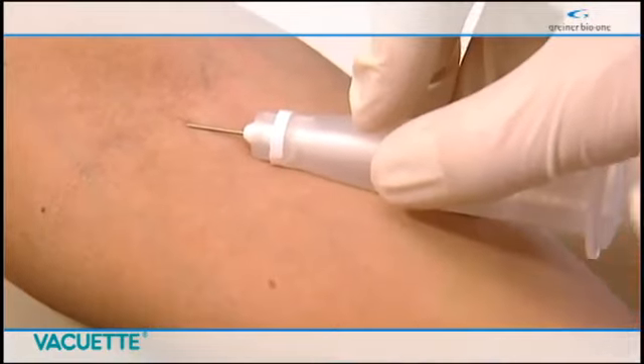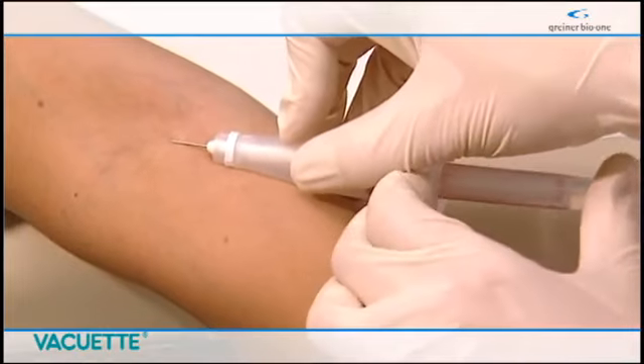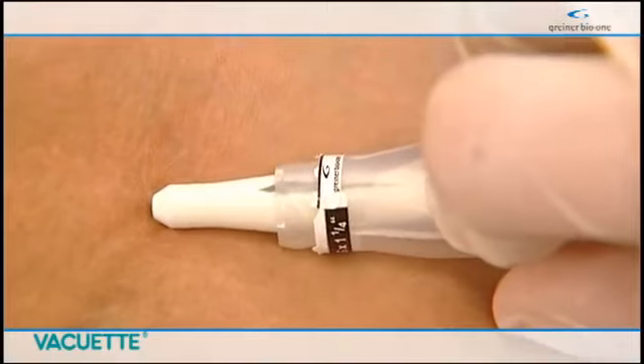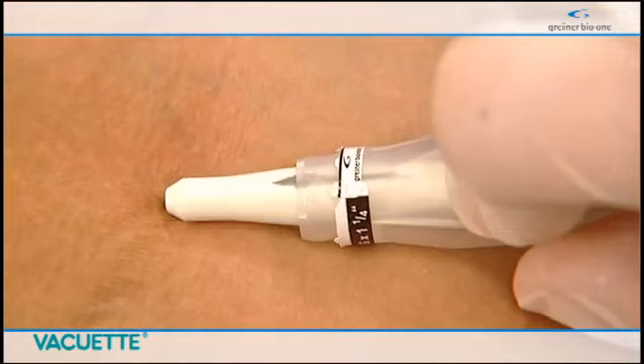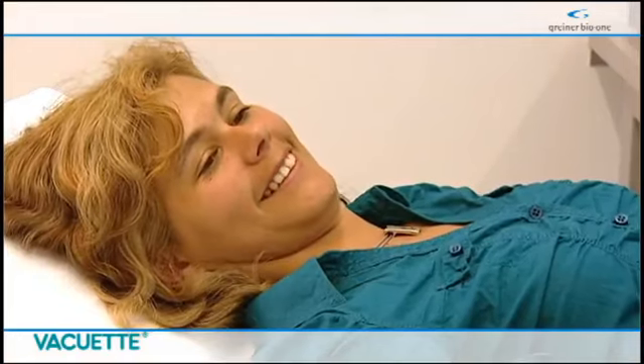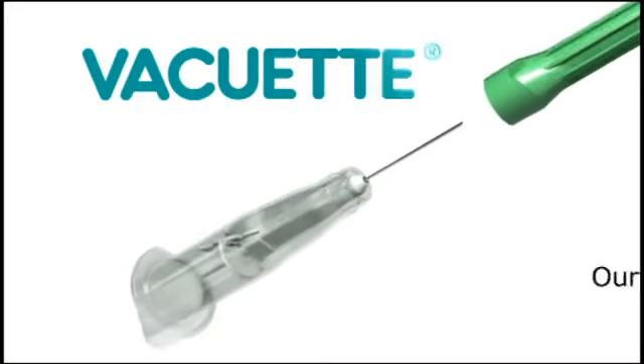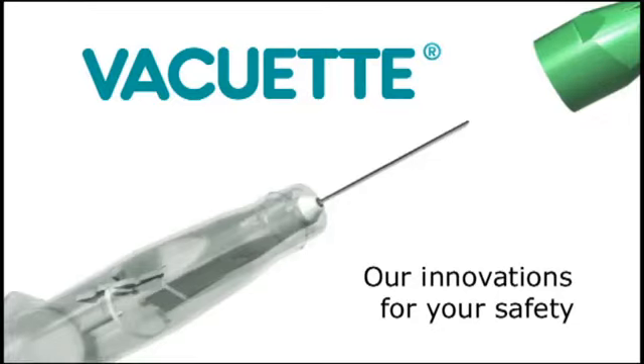The special design of the holder allows for puncture of the vein at a flat angle. The arrow on the protection shield indicates how far the needle is in the patient's skin. The Vacuette Premium Safety Needle System automatically removes the risk of a needle stick injury. Vacuette — our innovations for your safety.